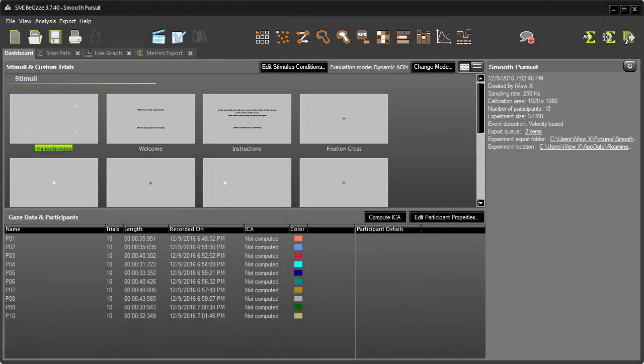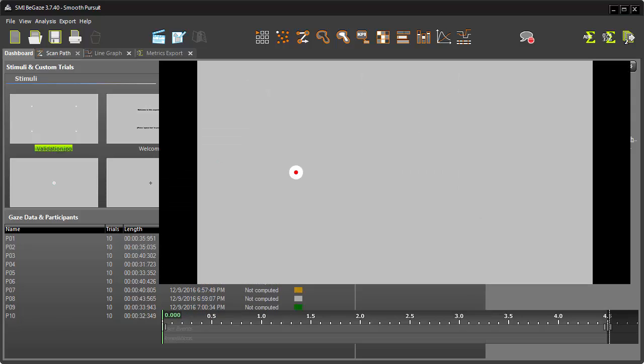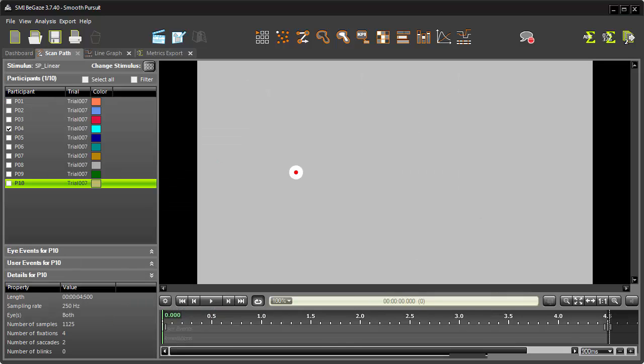Let's take a look at our experiment with ScanPath for just one participant. Here, you can clearly visualize the eye tracking involved with this experiment.